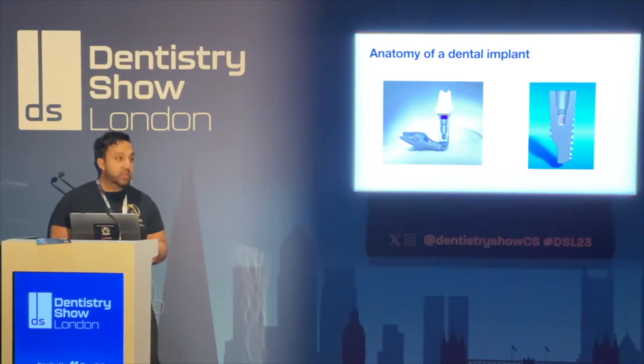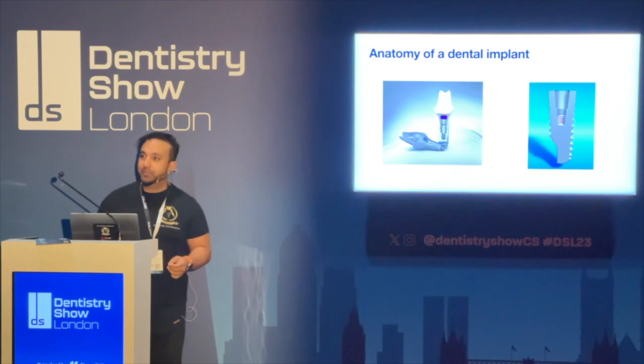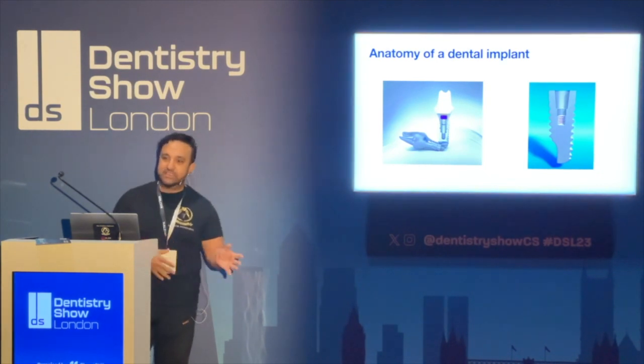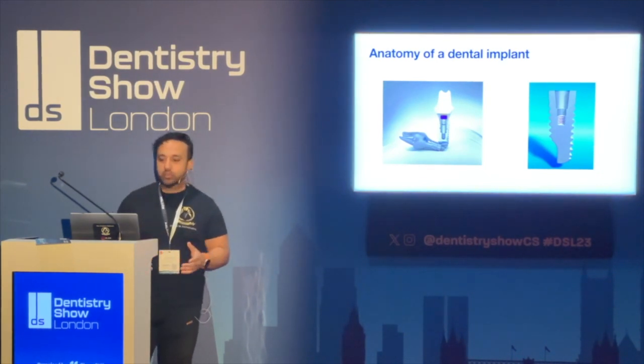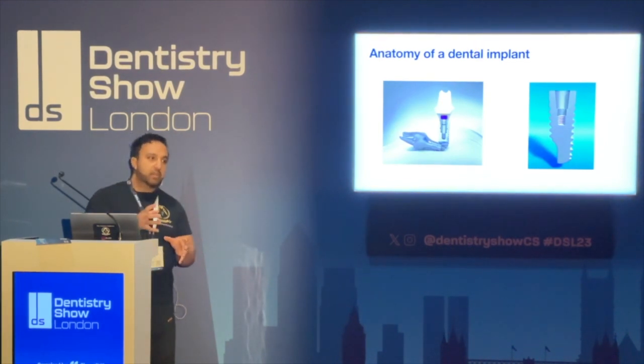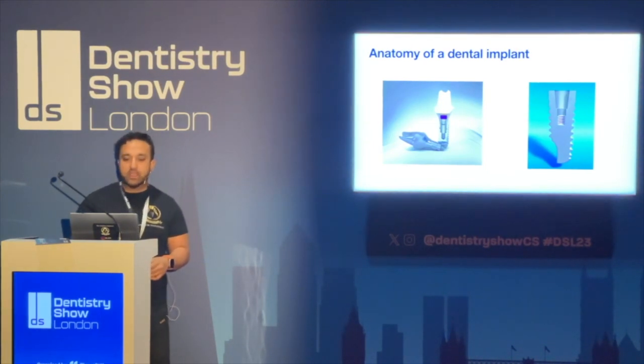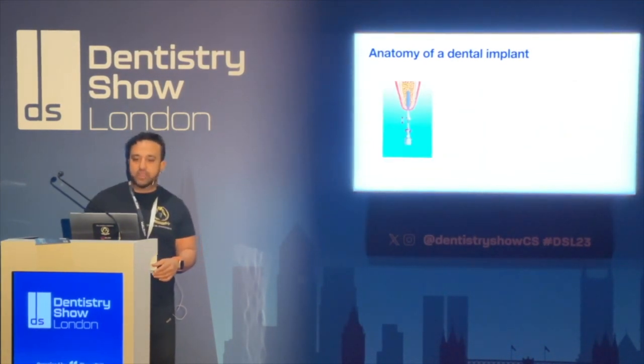And sometimes you'll find patients come with a little bit of a loose crown. I'm going to talk about that complication and how to assess it and deal with it, and decide what we're going to do to correct that issue. So you have the screw, the abutment, and the crown, and those three parts go together. I'm going to talk a little bit about that.